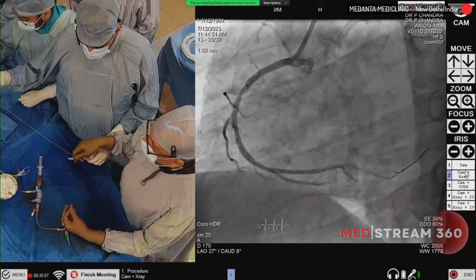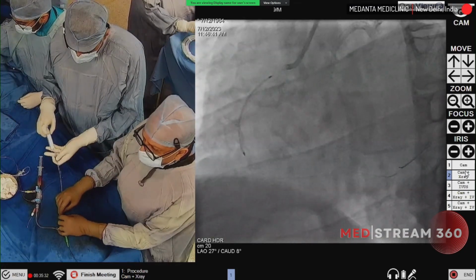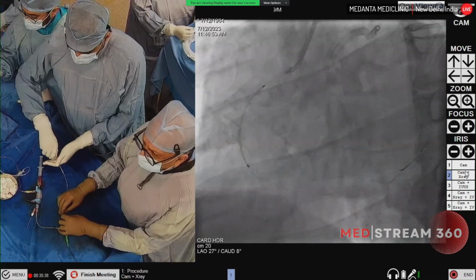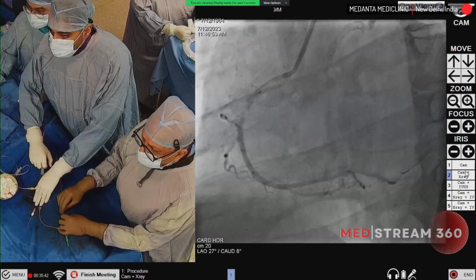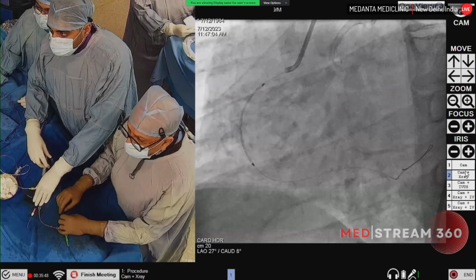So we are taking a 3.3 by 38. So this is a 3.3 by 38. And this is Zines Alpine. Check, please. In this area it looks okay. I think we are fine. Okay. Check, please.